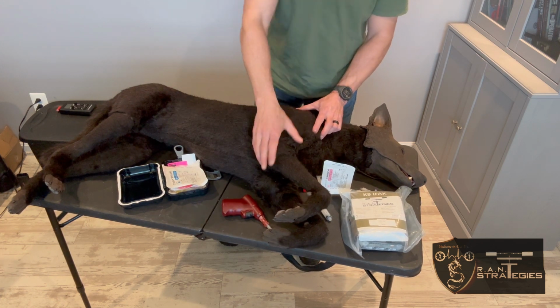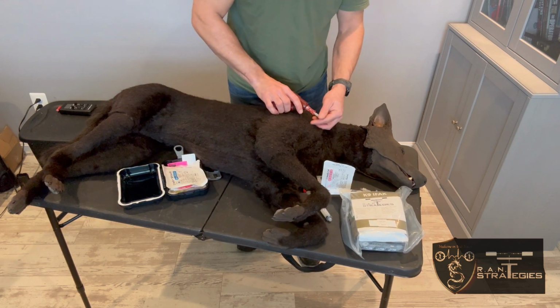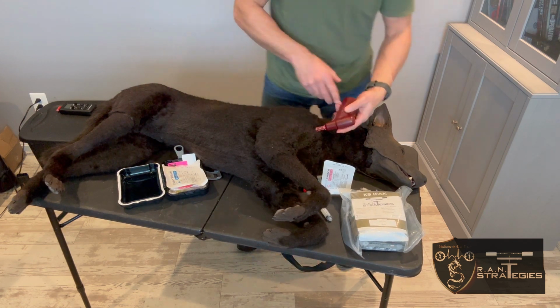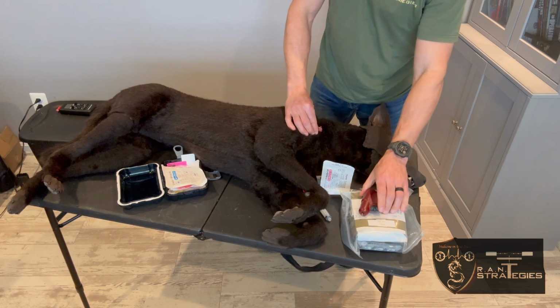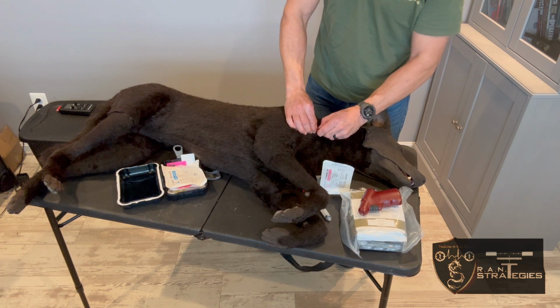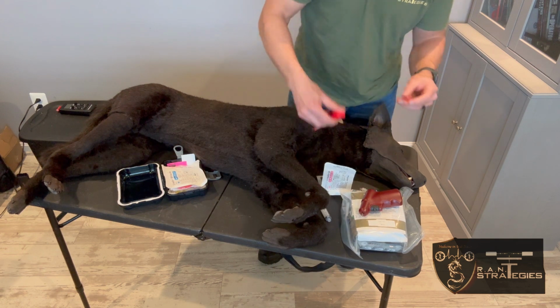So on a real canine patient, we would just do a little stab incision. For here, we're going to skip that, but we feel around, we locate our site, we remove the needle cap, we press it against, and we insert it. It goes down. We confirm we have a good hold. We'll remove the needle, secure our sharp.